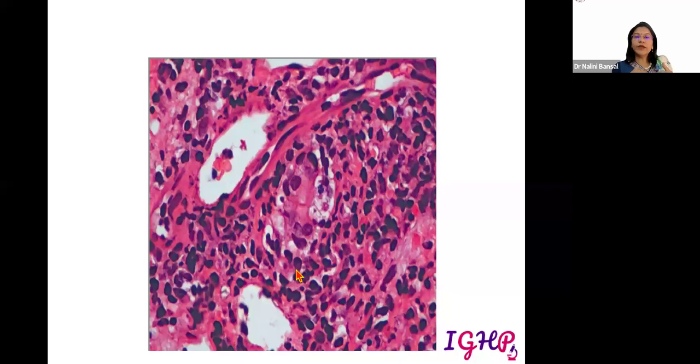Sometimes when the ductal lumen is disrupted, it is difficult to identify the duct within the portal tract. So therein you need to differentiate them from the inflammatory infiltrate occurring in the portal tract, and you need to be really sure that the thing you are looking at is actually a bile duct or something else. What you can do is get a PAS stain done to look for the basement membrane, but if the duct is completely disrupted, it would become difficult.